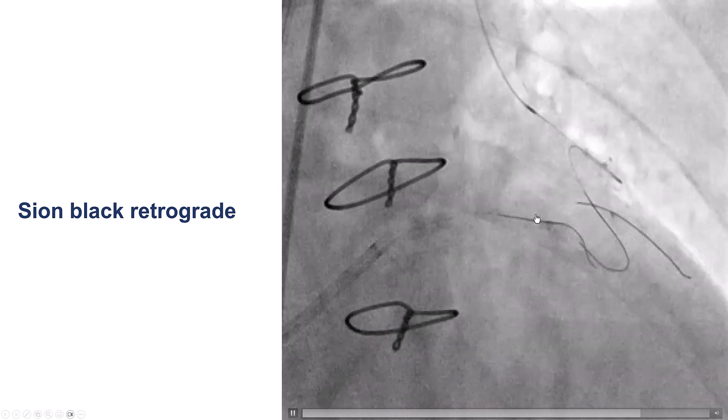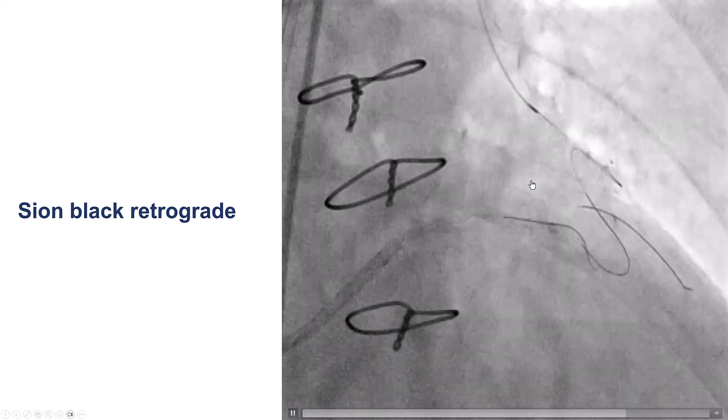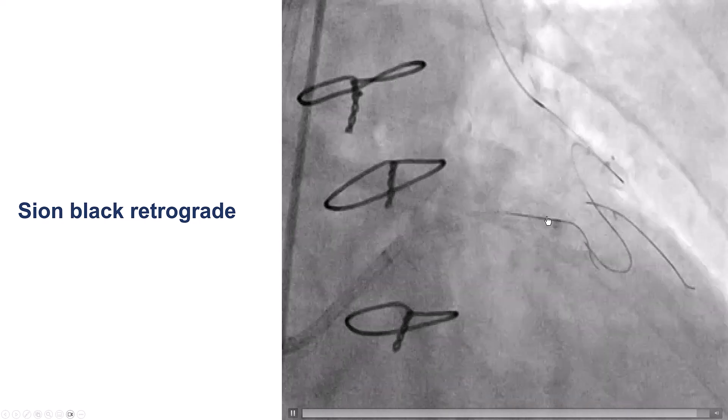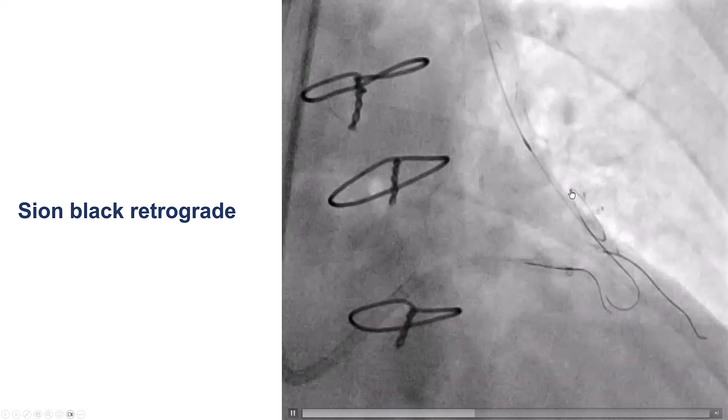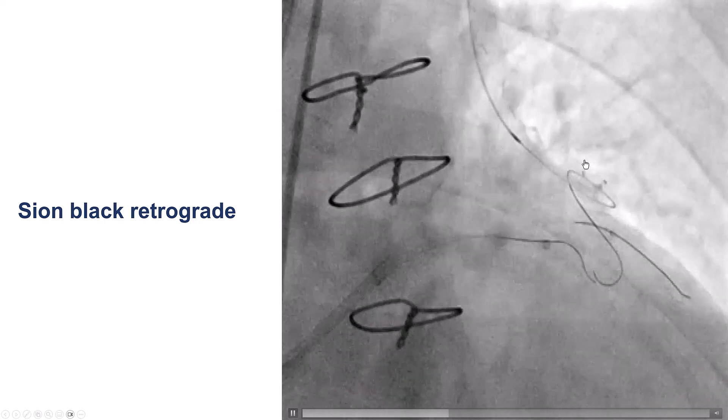After multiple attempts and failure to cross antegrade, we decided to go retrograde through the LIMA. The patient was hemodynamically stable, and we decided not to use hemodynamic support, although it is something to be considered, especially when going down through tortuous LIMA grafts.